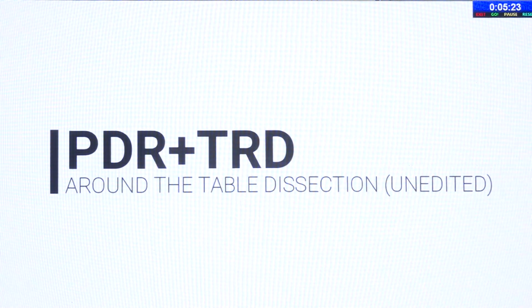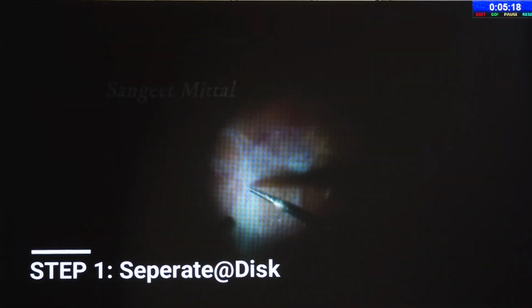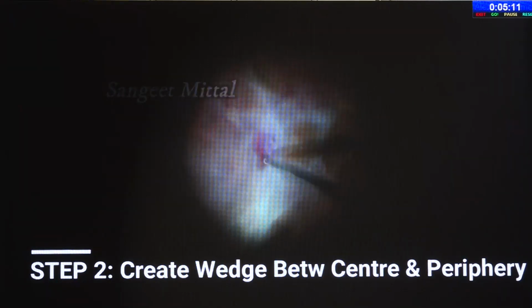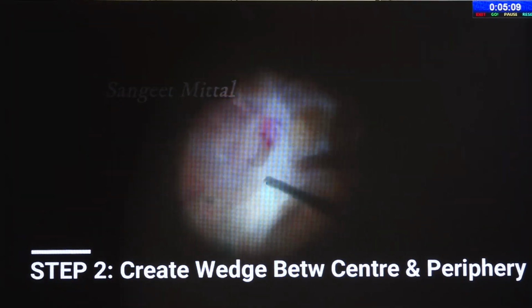So this is a small video, and this membrane dissection part is totally unedited. The patient had a lot of this membrane. So once I've separated the membrane from the disc, now you see it is totally unedited. I've not cut anything, only the speed is a little faster, two times in the interest of time. You just see I've separated the membrane of the disc. Now I advance my cutter, I cut the membrane like a wedge and advance to the periphery from the center.